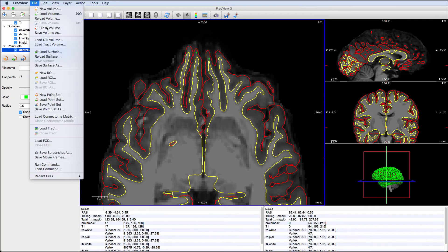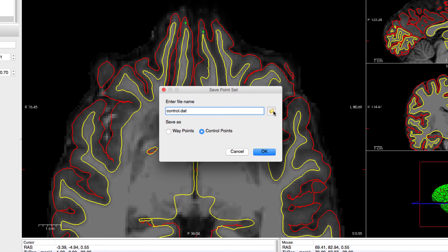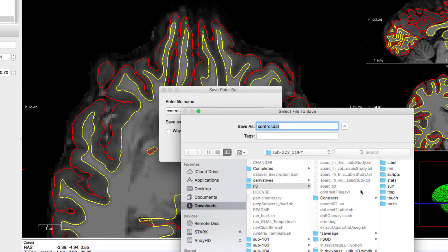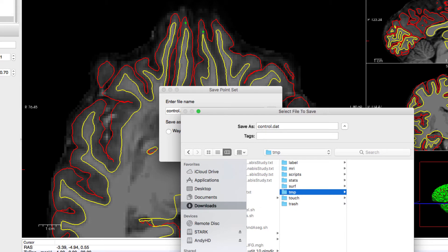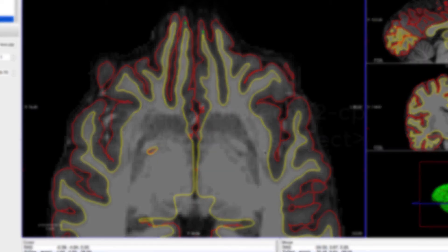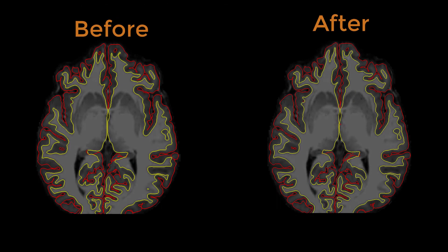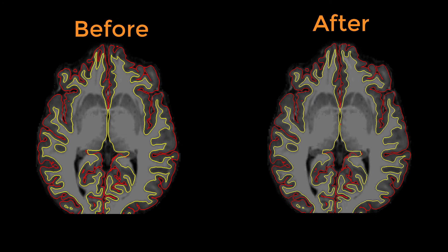When you're done, click on File, Save Point Set As and call it Control.dat. Save it in the temp folder. Then run this command. When it finishes, compare the white matter segmentation before and after.